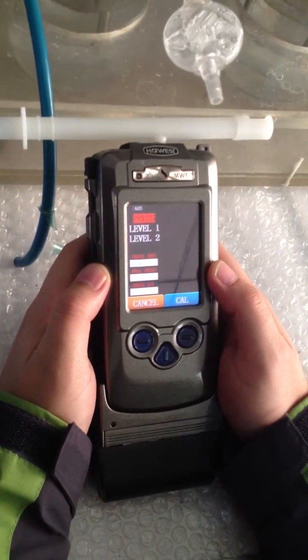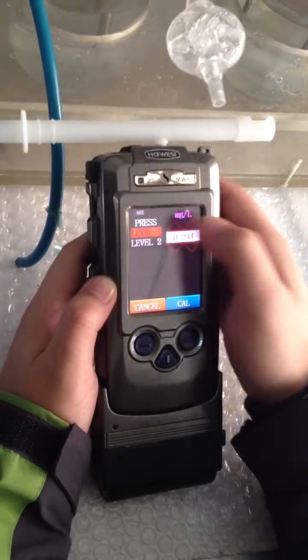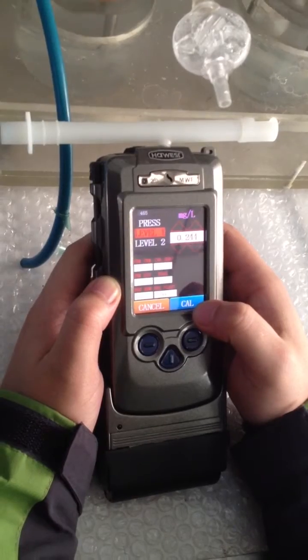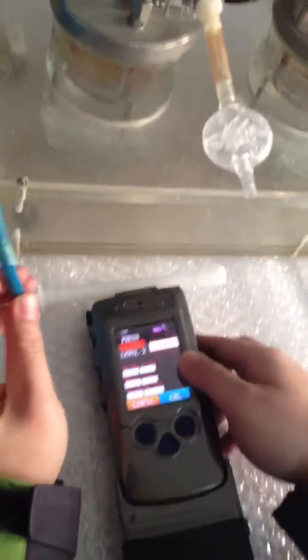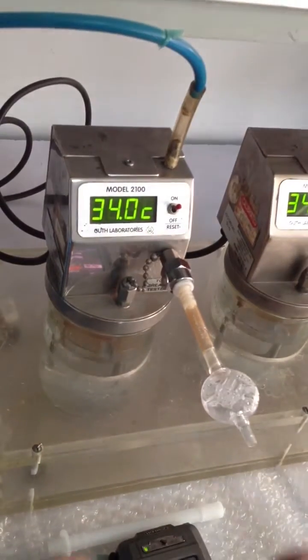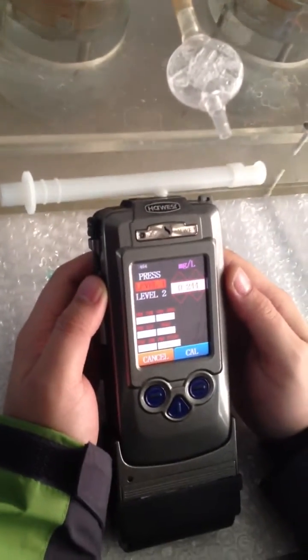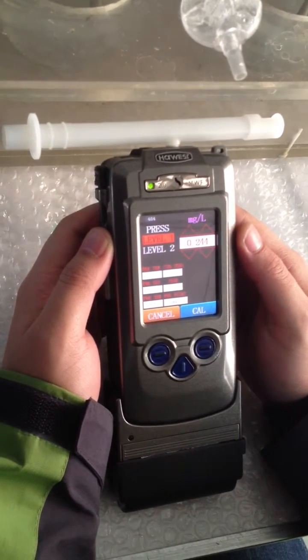Now let's move on to the alcohol calibration — Level 1. Before clicking the calibration key, let's do some preparation. We connect the mouthpiece. Also, when doing the alcohol calibration, we need to adjust the flow rate to be 10 liters per minute.